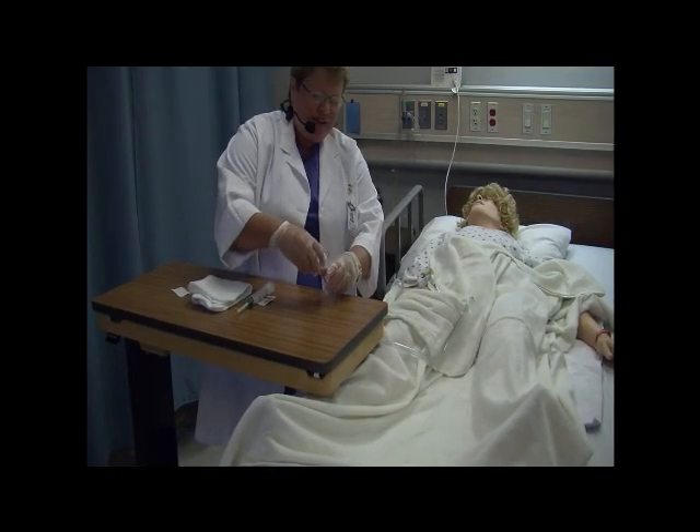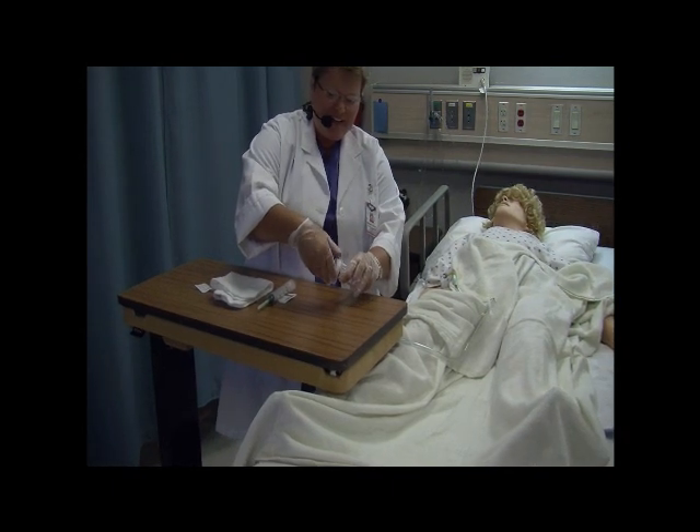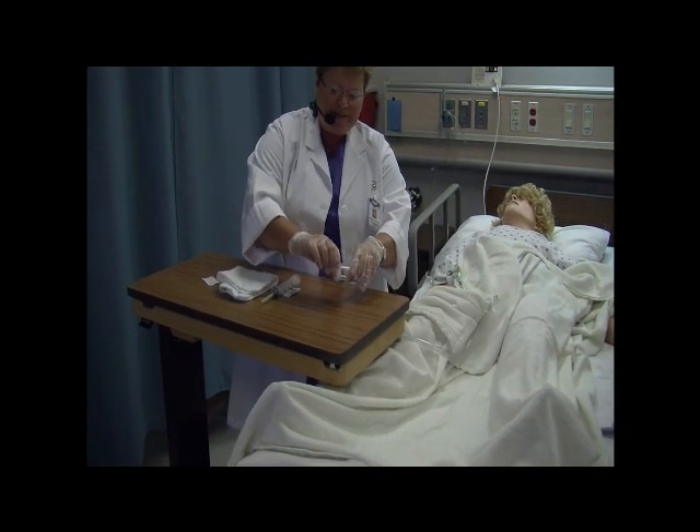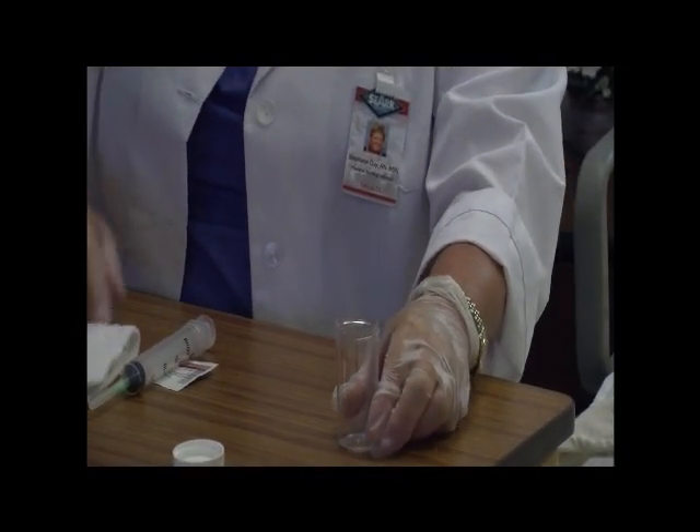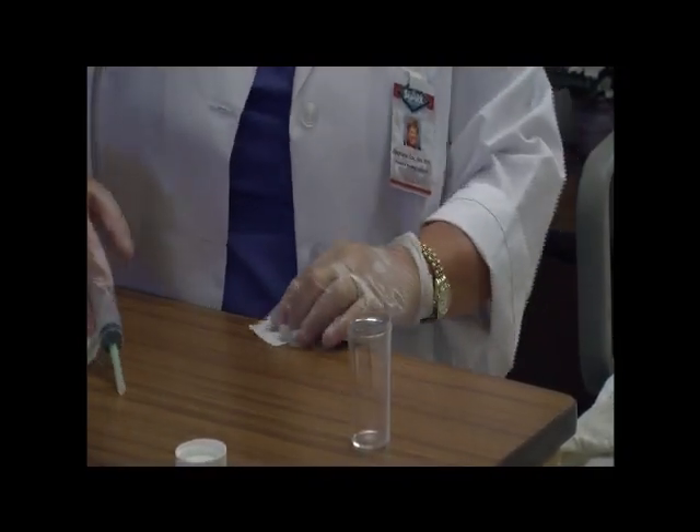All right, Ms. Green, looks like we've collected a little bit of urine there. I'm going to open my container. When you open the container, keep your hands from passing over the lid or over the container so that you don't get microorganisms in them.